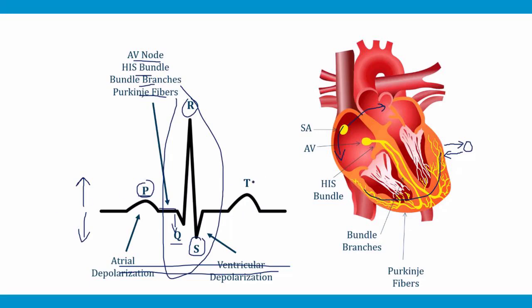Then finally, the last little bump we have on an EKG lead depicting the cardiac cycle is the T wave, and that's caused by the ventricles repolarizing after they have depolarized. So after this whole thing occurs, we've gone through an entire cardiac cycle of all the electrical activity being conducted to the atria and ventricular myocytes so that all four chambers can contract and pump blood.